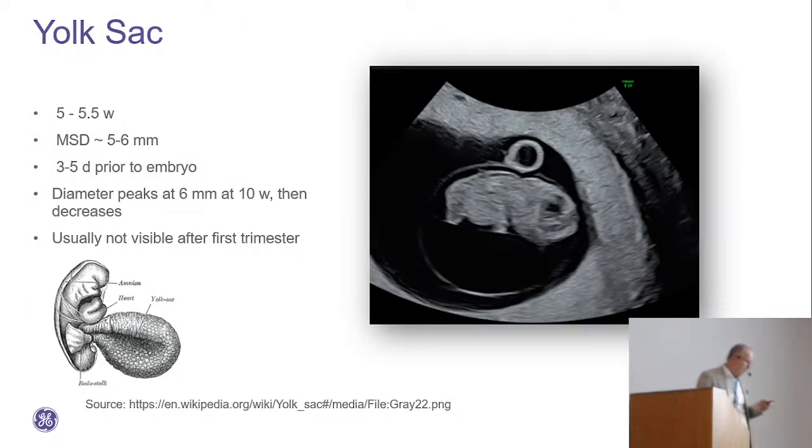What is also very nice to do if you have the 3D probe, try in the early pregnancy, try to make a 3D in this one. I had just a discussion this morning, said, okay, when you have the probe, and you do the early pregnancy scan vaginally, make a sweep. And then the images are really fantastic. It's even easier than doing a baby face because you have fluid around. But it's very interesting to do.